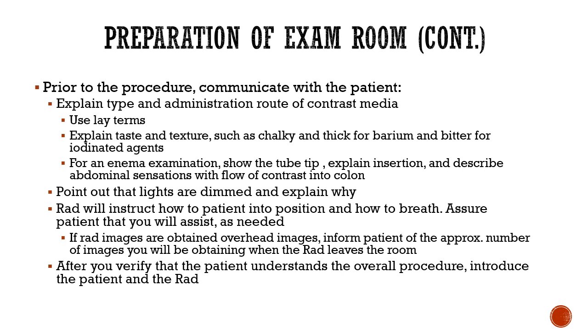The radiologist will instruct you on how to get the patient into the position and how to breathe, and will assure the patient that you will assist them as needed as well. If radiology images are obtained, like I said, just overheads, you're going to inform the patient of the approximate number of images you'll be taking when the radiologist leaves the room. After you verify the patient understands the overall procedure, introduce the patient and the radiologist.